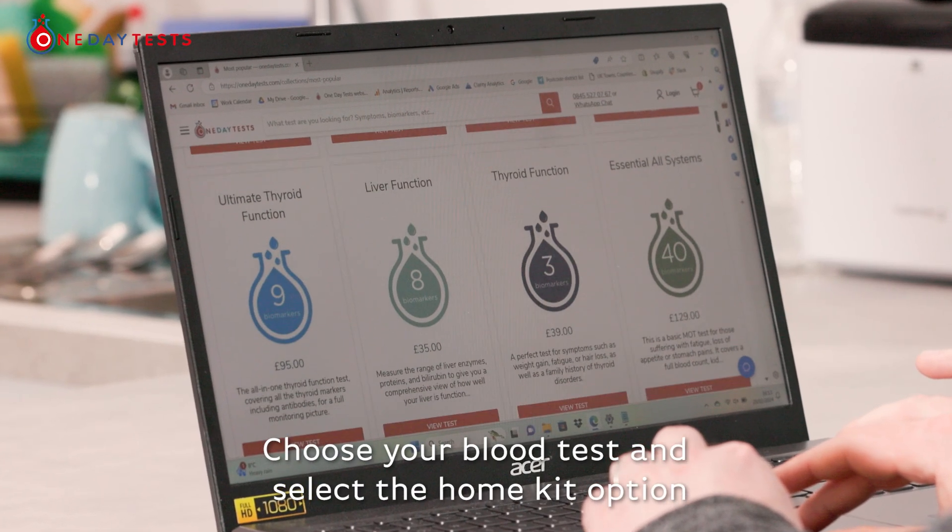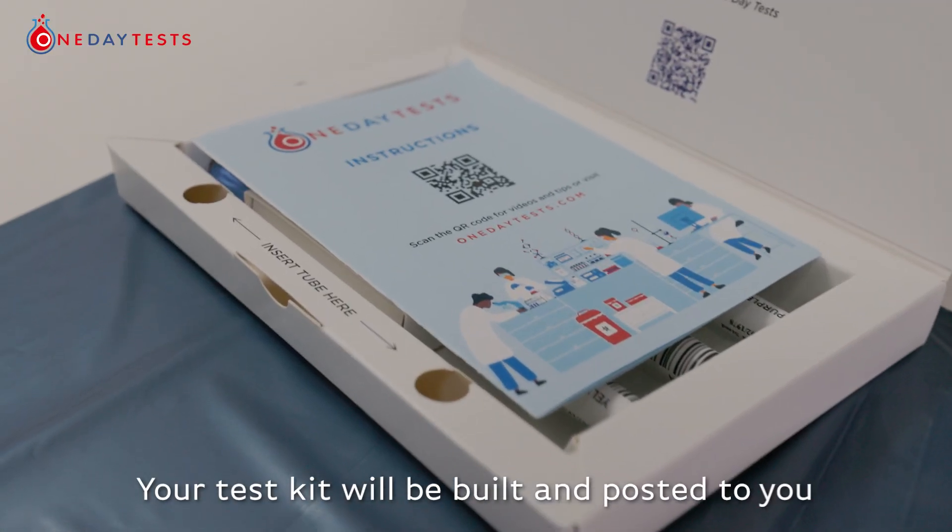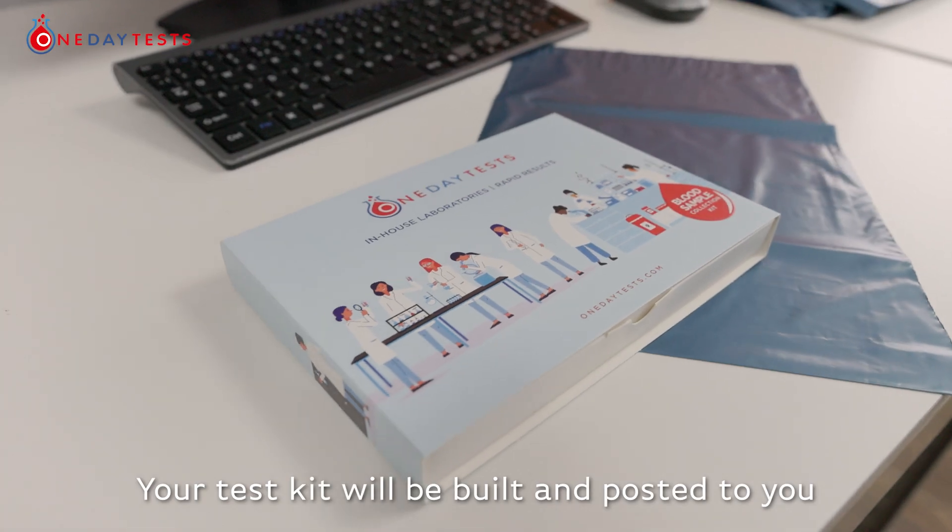Choose your blood test and select the home kit option. Your test kit will be built and posted to you.